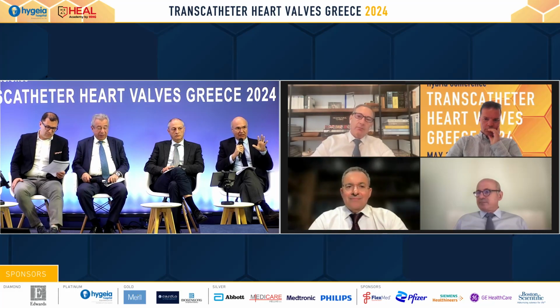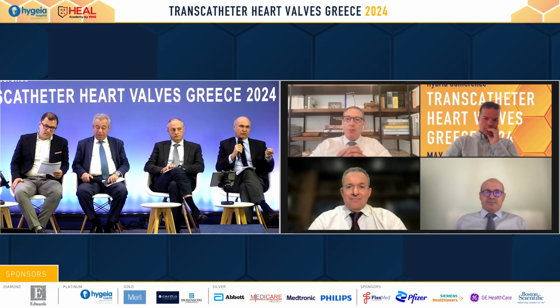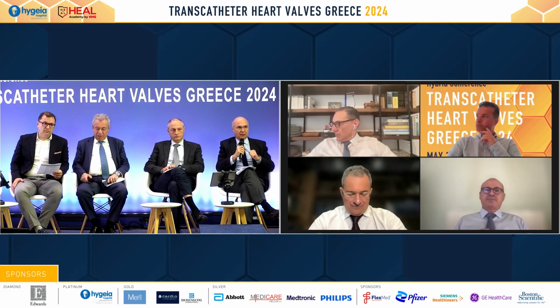For TEER, is all the information you need from echo, just from ultrasound? Because I understand that for transcatheter TMVR and for MAC, we need a lot of information from the CT. Do we need a CT, or can TEER go ahead only with information from echocardiography?